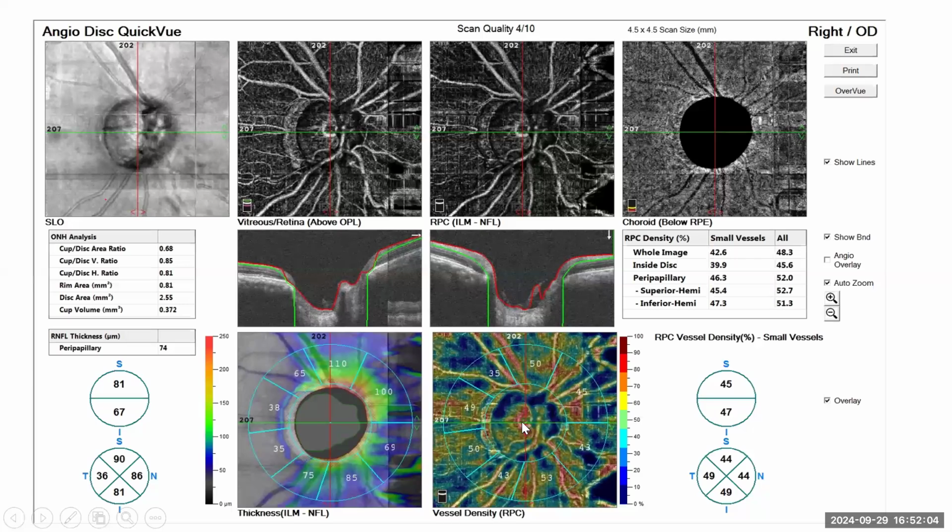And if you look at the map, I'll show you something. The quantitative part is counting, seeing the numbers displayed, while the qualitative part is looking at the numbers and the area of interest and finding out that there are areas that appear bluish in color. Those bluish areas are areas of capillary non-perfusion at the time of this capture.